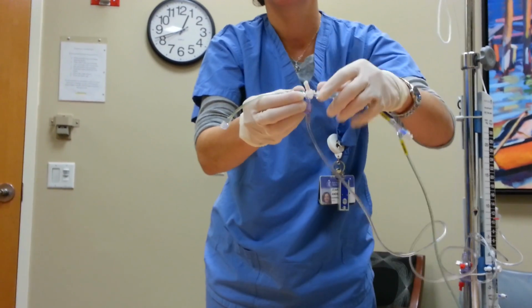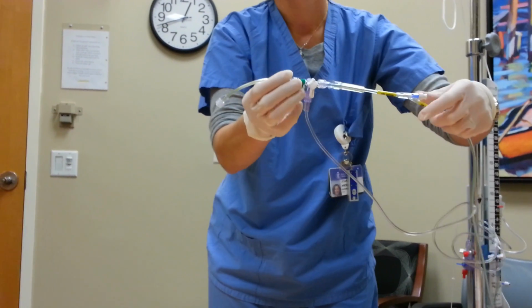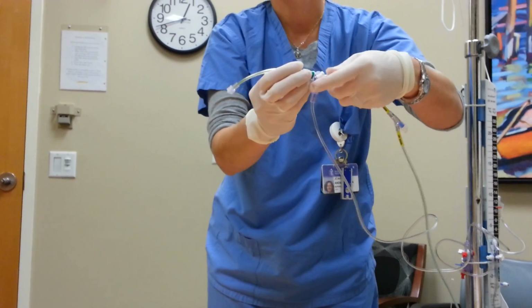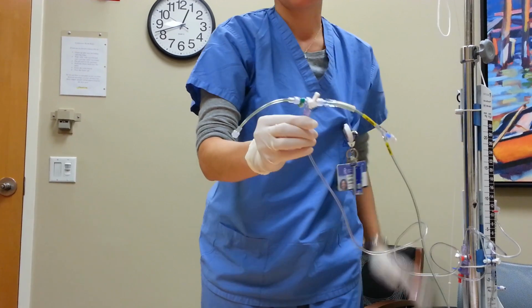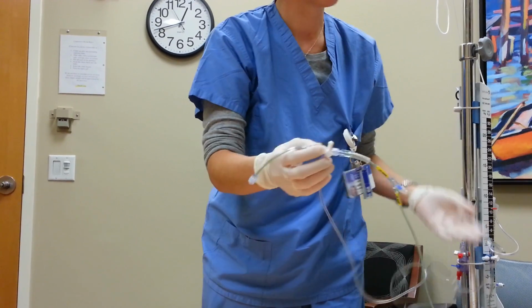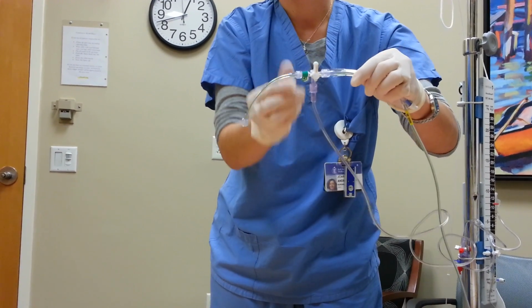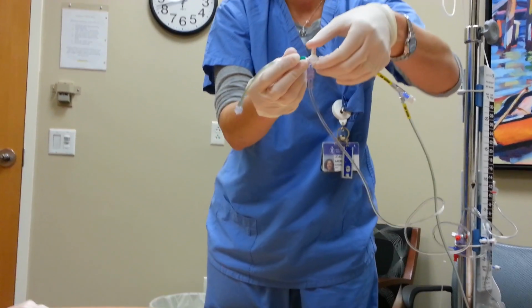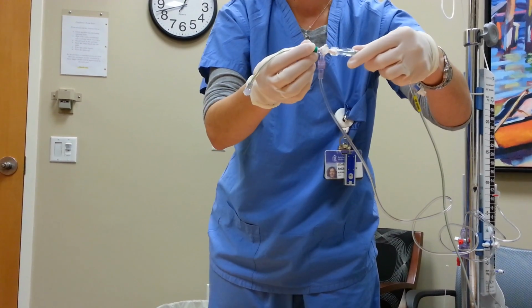You might wonder why not just turn it off to transducing altogether, but it's an important safety mechanism. We want this to alarm if it becomes disconnected. We want it to alarm if this were to suddenly change position. You would see the ICP go up very, very high. It would be false, but it would let us know that the position has changed. So it's important to keep it transduced at all times. However, if you want a real ICP, you turn it off to drainage. Let it settle out for a minute and you'll get an ICP.